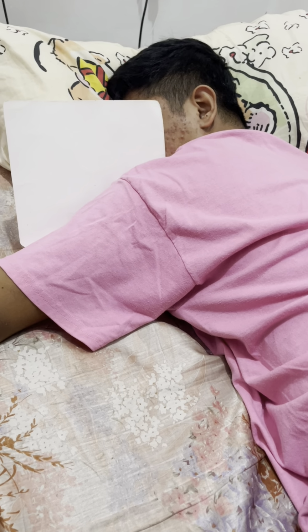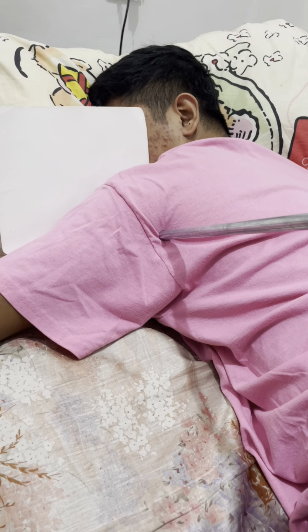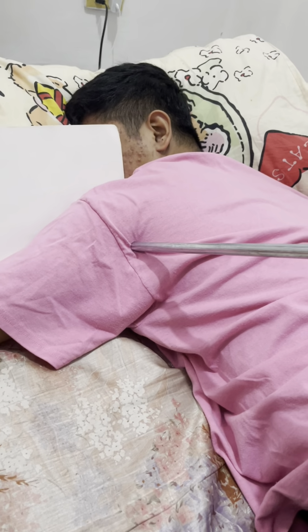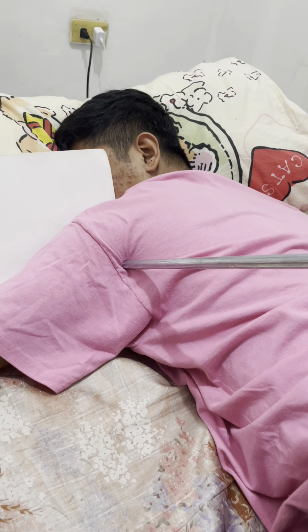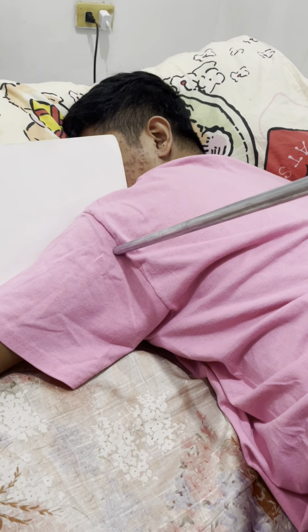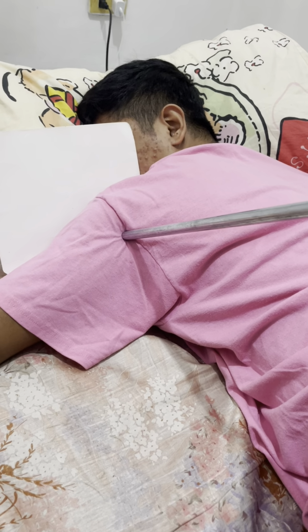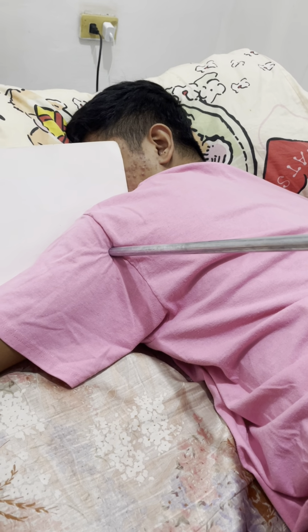This projection is infero-superior axial projection West Point method, directed at dual angle of 25 degrees anteriorly from the horizontal and 25 degrees medially. The central ray enters approximately 5 inches inferior and 1 1/2 inches medial to the acromial edge. It exits the glenoid cavity. It shows the humeral head projected free of the coracoid process.